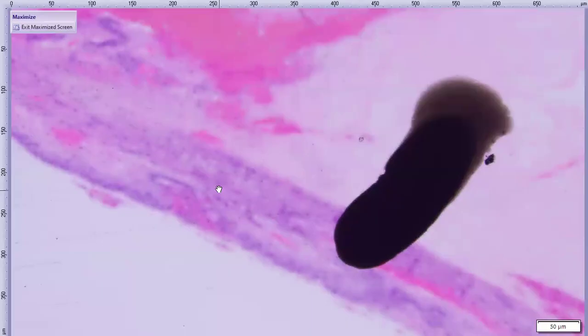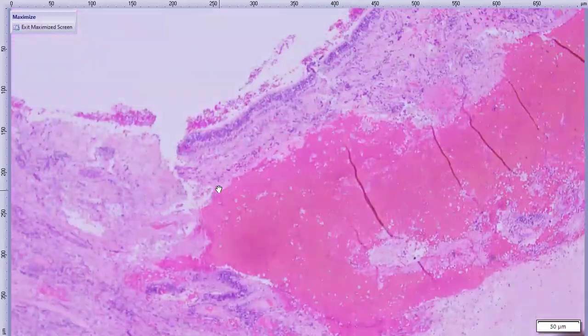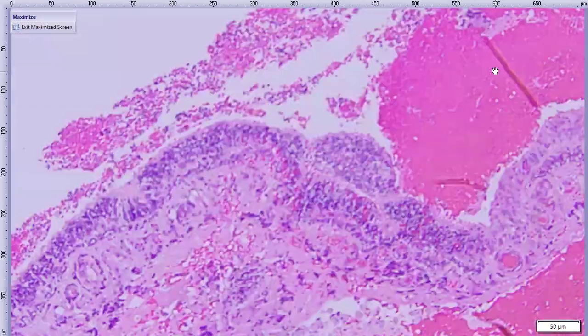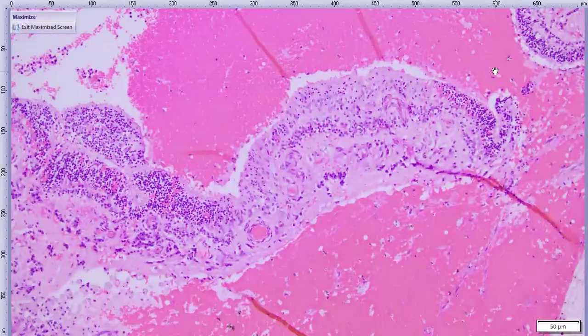And then we can move on and look at our retina. As I mentioned, it is detached. There are areas where it maybe even looks torn. There's a weird kind of blunt rounded end right here. There's areas of full thickness atrophy. I can go on closer, where we have jumbling and loss of the retinal layers.